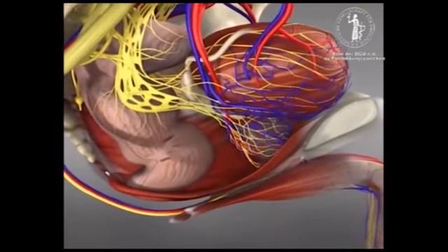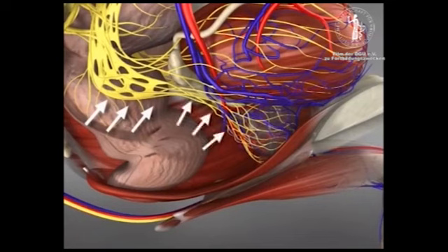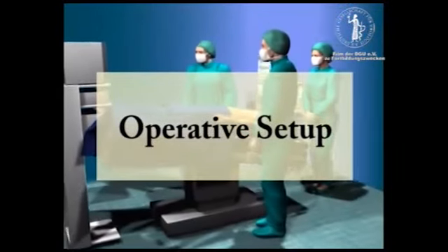In intrafascial nerve-sparing radical prostatectomy, the pelvic plexus, the neurovascular bundle, and the prostatic plexus, a distribution of nerve fibers on the lateral surface of the prostate, are preserved in order to obtain the neurovascular integrity.